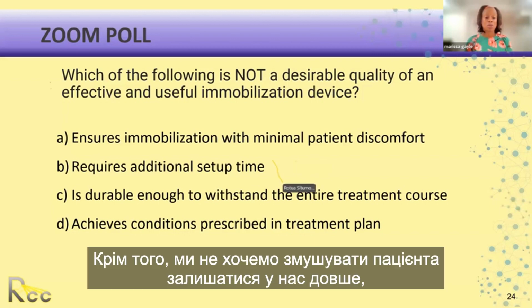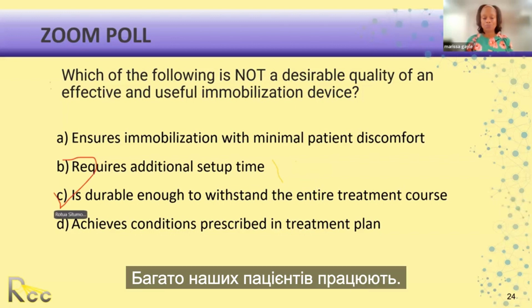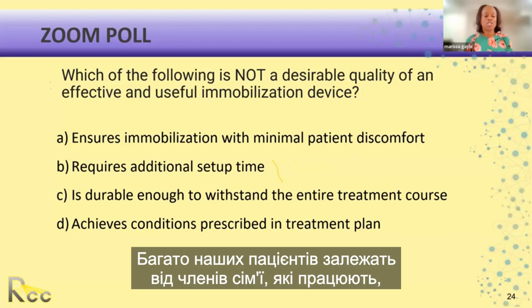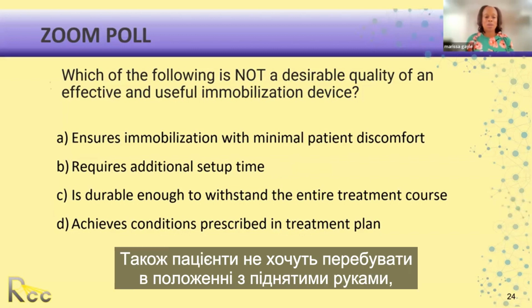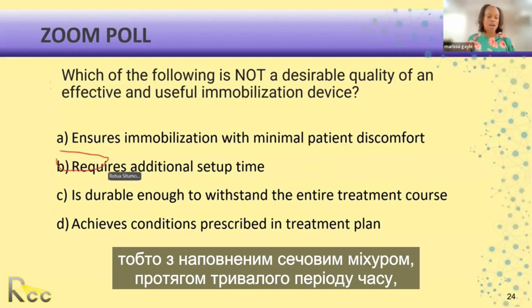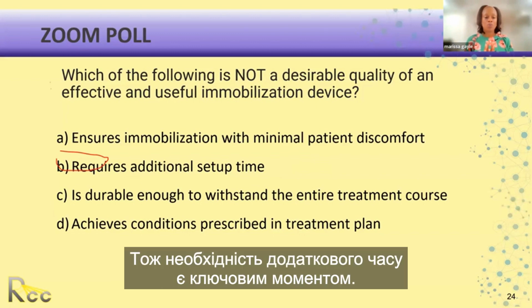That's for us. Also, we don't want to make the patient be there any longer than they have to. A lot of our patients work. Many of our patients depend on family members who work, who bring them and have a set time constraint. So also patients don't want to be in a position with your arms up, bladder full for an extended period of time that they don't necessarily have to. So requiring additional setup time is key.